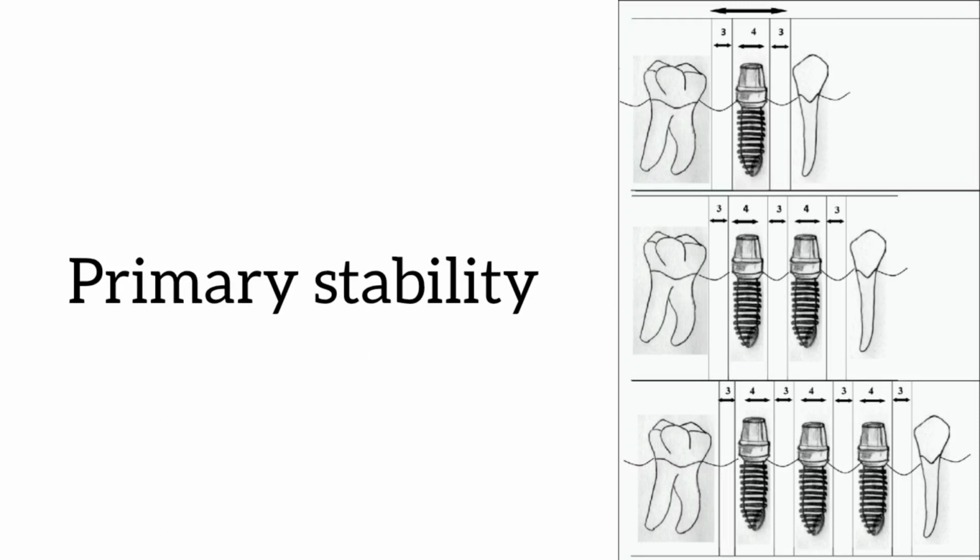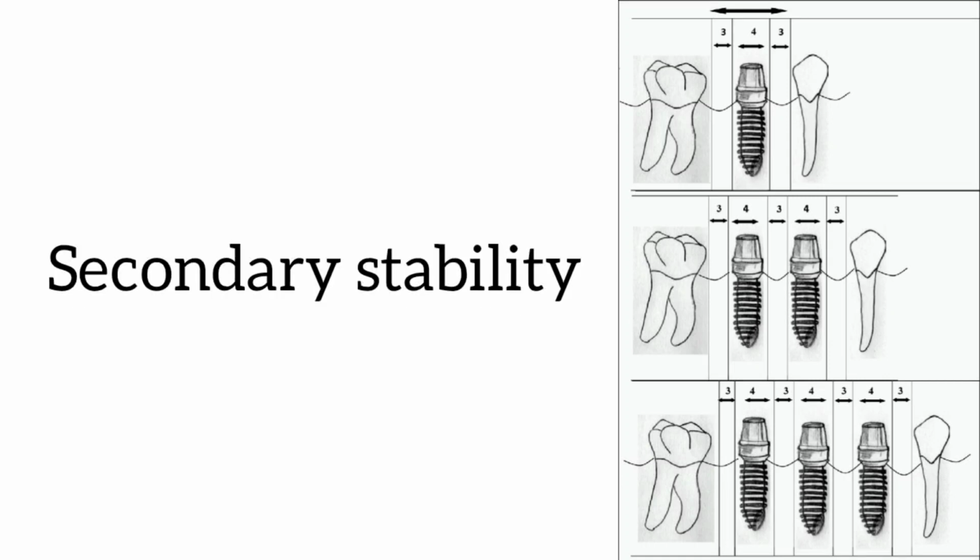Primary stability refers to the mechanical engagement and interlocking between the implant interface and the jawbone when the implant is inserted. It is the mechanical engagement. Next, what is secondary stability? It offers further stability to the implant biologically by bone regeneration and remodeling. Hence, new bone is formed around the implant. Primary is our mechanical engagement and secondary is further bone regeneration and remodeling.